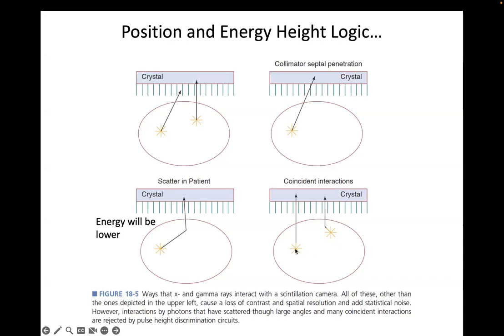The other thing that can happen is you can get a good signal here. Everything just went right. Here we had a change in energy because we get a scatter of this photon and it comes up here. And so now we have a flash that are coincident. And then the system tries to compute where that flash came from, the weighted sum of those signals. And it might pass the energy threshold, because it has high enough energy, certainly. This is the composition of both these events. And so it would tell you, oh, you had an event somewhere down here. And so again, these kind of scatter events cause essentially a cloud of background activity in your image. And so that raises up the background of the image with this fuzzy cloud of scattered events.